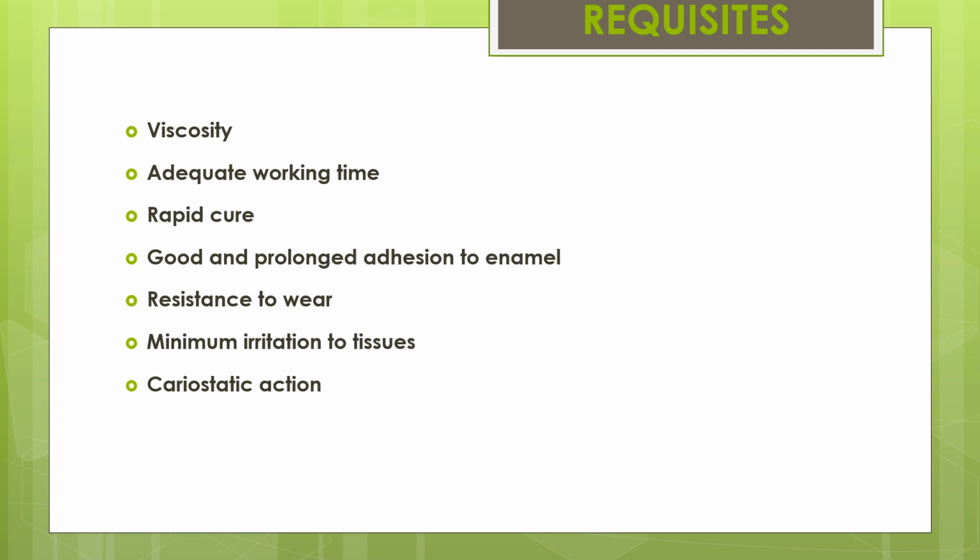Now to the ideal requirements of a pit and fissure sealant. Firstly, it should have a proper viscosity so that it can flow into the fissures as it is being applied. An adequate working time, rapid cure, good and prolonged adhesion to the enamel, resistance to wear for better durability, minimal irritation to the tissues, as well as a cariostatic action.